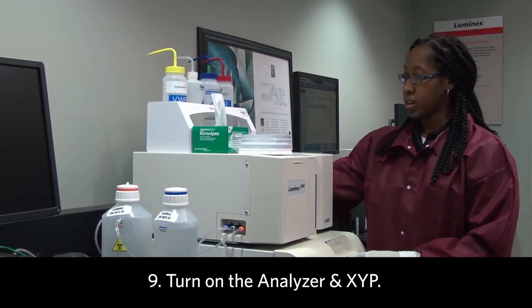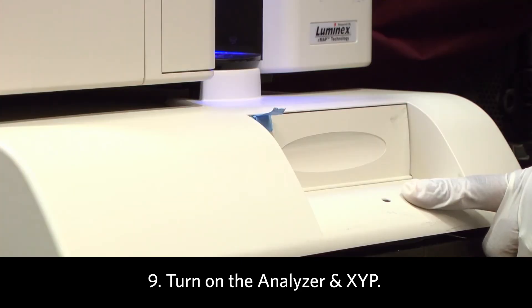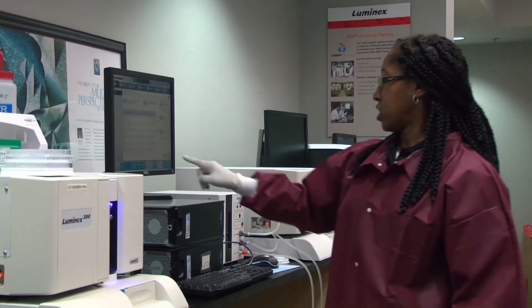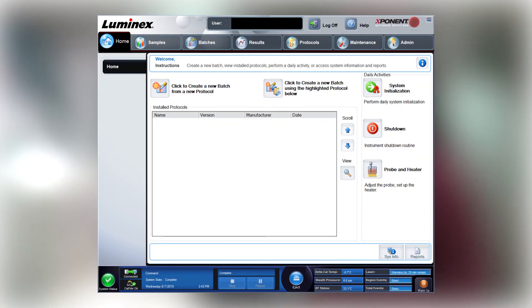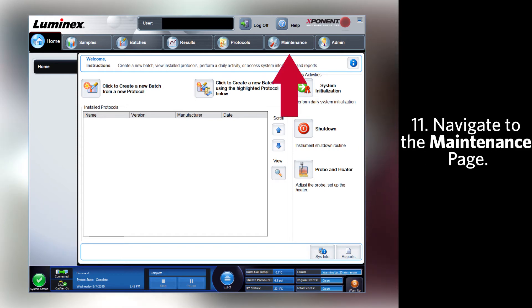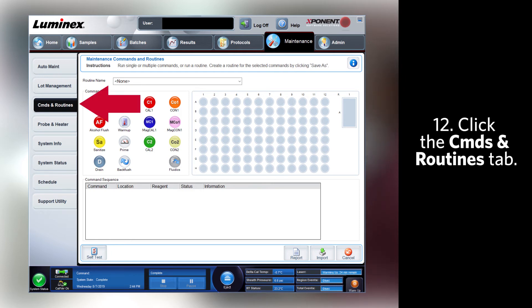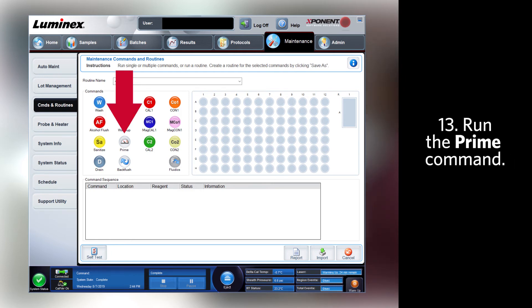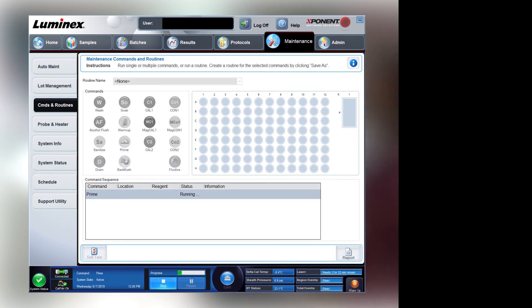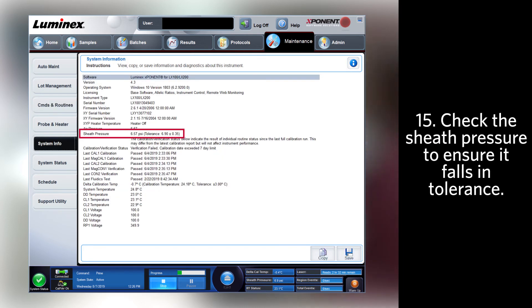Now, turn on the analyzer and the XYP. Once the software shows that the analyzer and the system is connected, we're going to check the sheath pressure. Navigate to the maintenance page and commands and routines and run a prime. Once the prime starts, navigate to the system info page and check the sheath pressure to make sure it falls within tolerance.